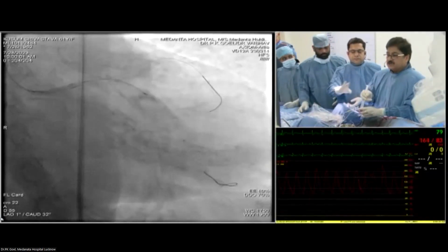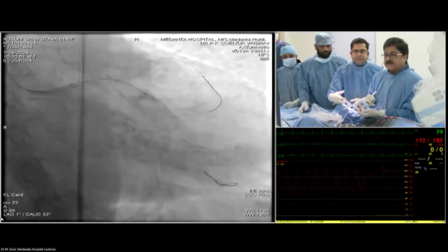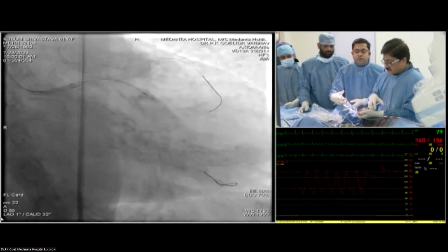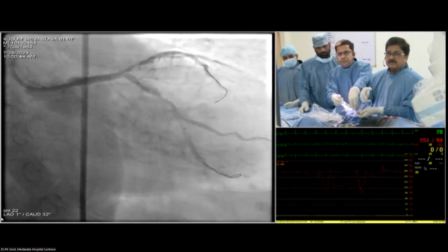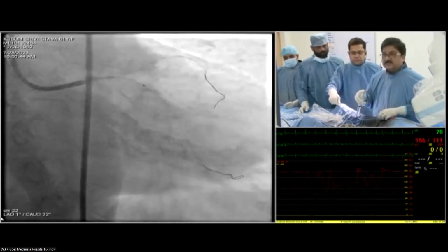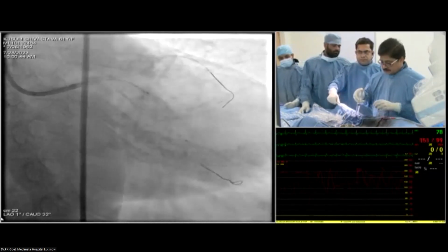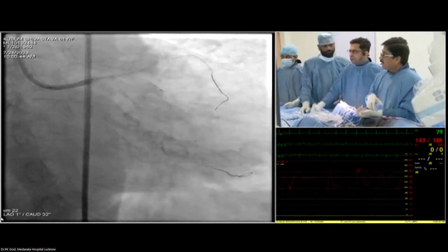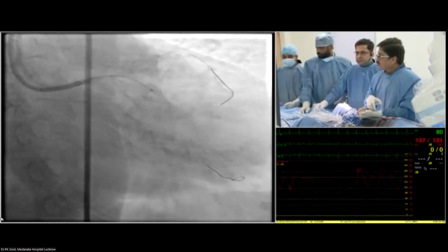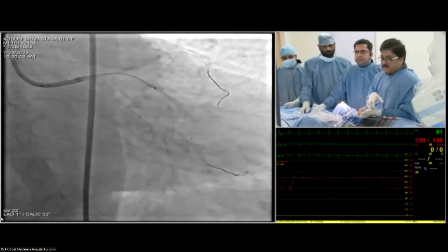Okay, so I am doing it now, right now. Just do a purge, please. What do you think about the EBC main results, Dr. Pathak? Okay, I am ready. EBC main, the left main.